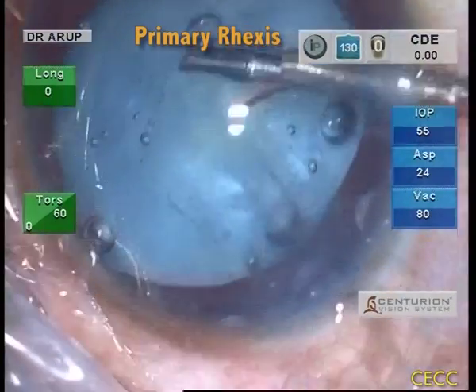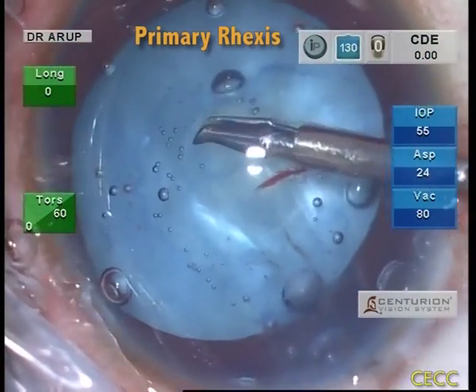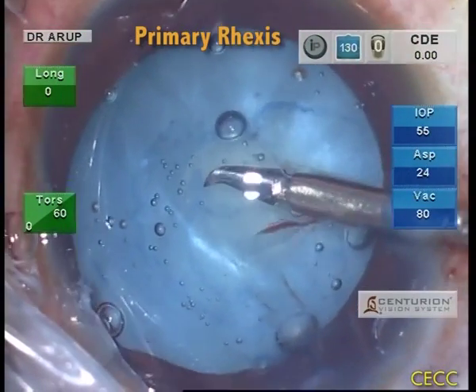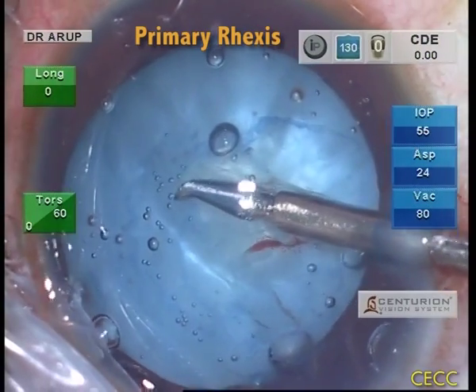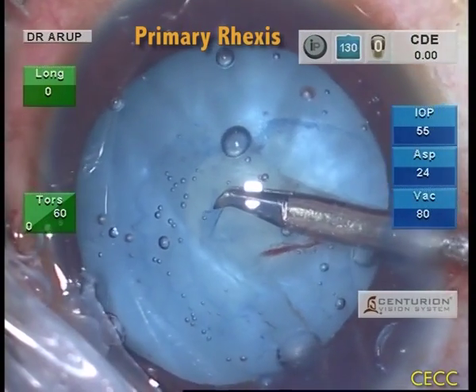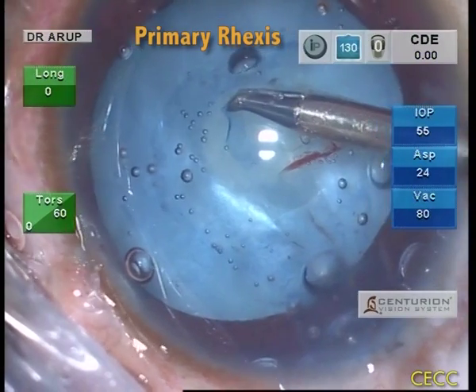Though there was a minor hiccup at some point due to two radial capsular tears occurring during capsular puncture with the cystotome, it was successfully managed. At this point, what we want is a continuous RHEXIS regardless of its size and shape. The surgeon should have full control on how the tear progresses.